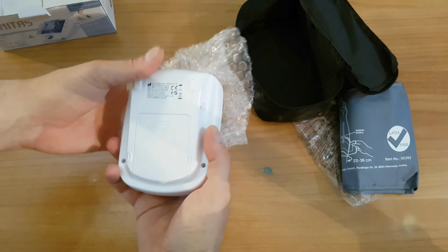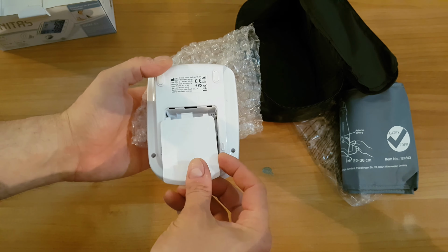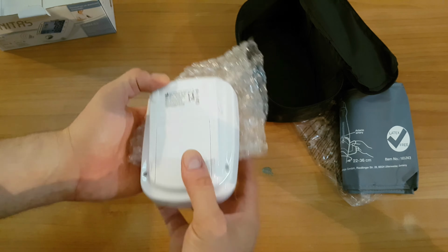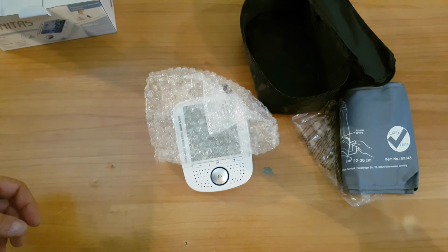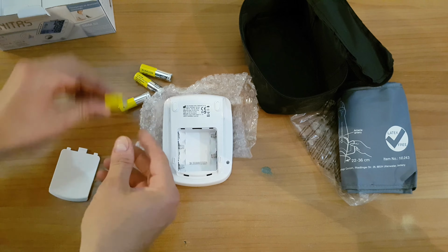Now to work with that we will need 4 AA batteries, 1.5 volts. Let's find them and install them. Okay, here we are, 4 IKEA batteries.